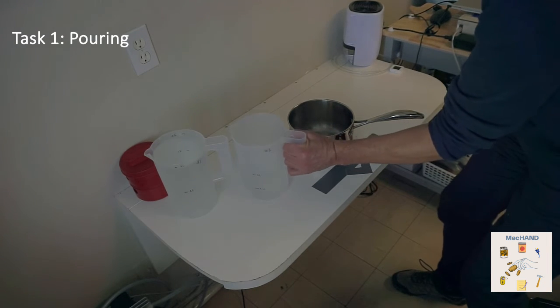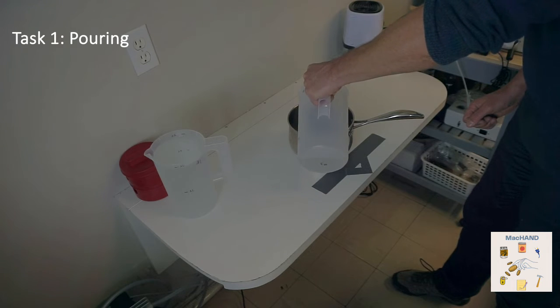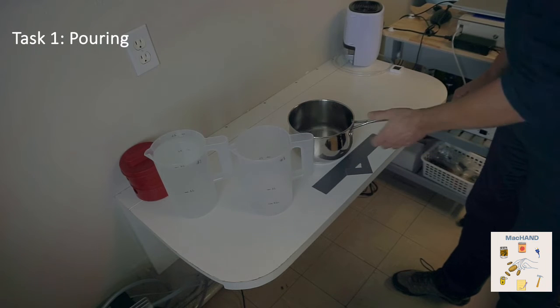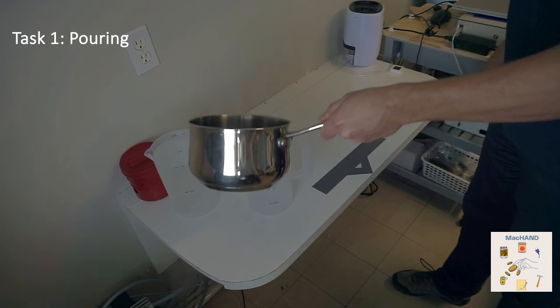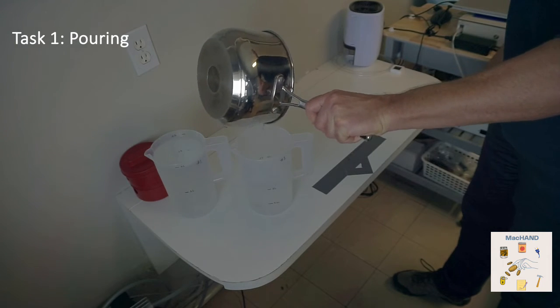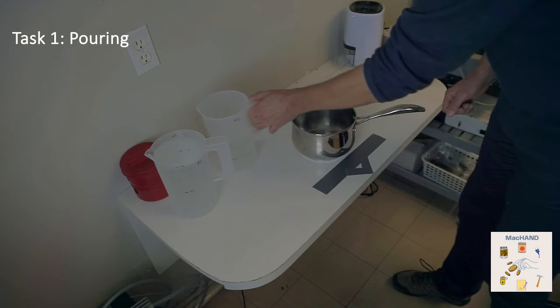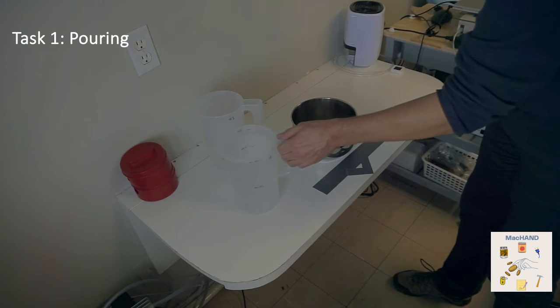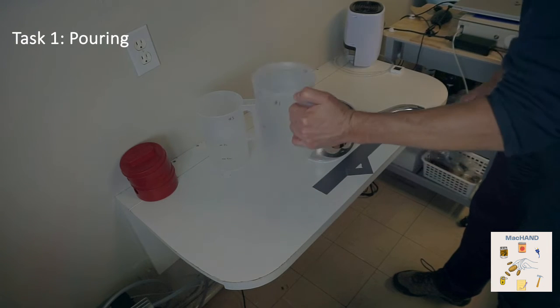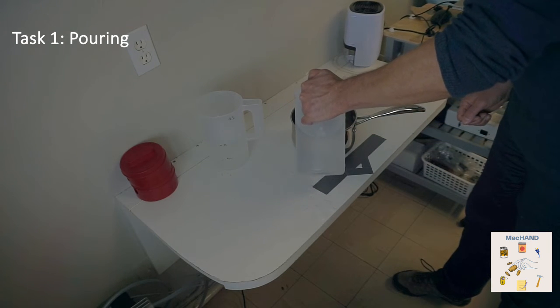The patient will need to pour half of the water from the first jug, which contains 1 liter of water, into a saucepan, and then put the water from the saucepan back into the jug. The patient then does the same thing with the second jug, which contains 2 liters of water. The assessor's focus is on the power grasp, pronation, supination, coordination, and endurance. We recommend having a towel close by since some water always tends to spill on the table. The person is only penalized for this if a large quantity of water is spilled.